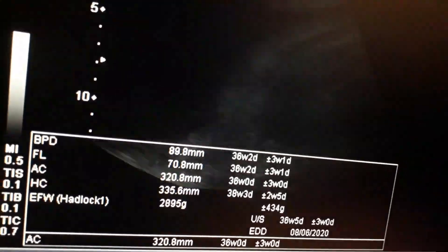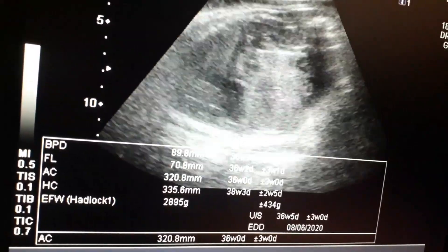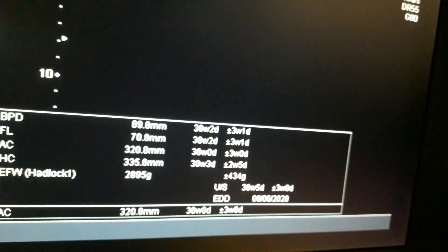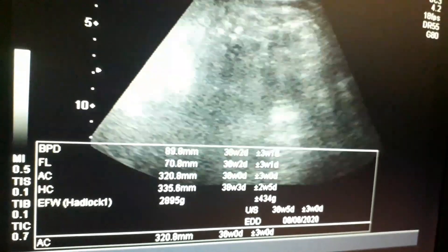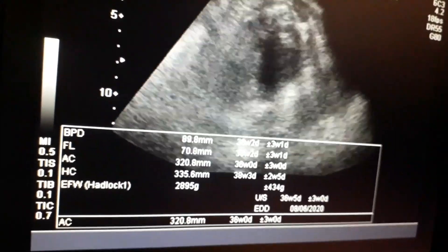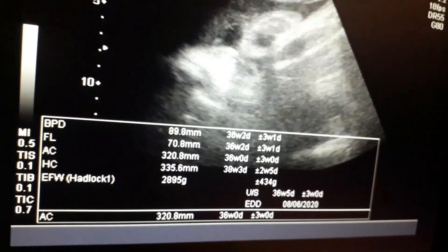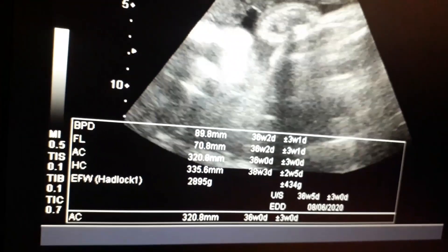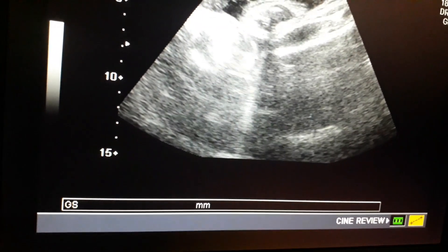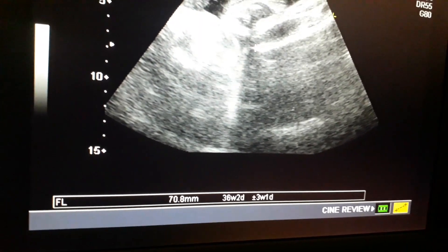Alongside that you can also appreciate the placental lobe and its lower edge. This is the abdominal cavity and spine, and I am just trying to locate the femur of the baby. Now I have focused it. I am going to calculate the femoral length from the greater trochanter to the lower end — it is about 36 to 37 weeks.